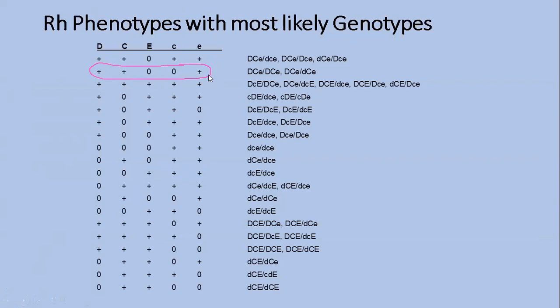Okay, so that's basically the phenotype, and we just happen to get the phenotype using the gel method instead. And so in this case, the most likely genotype would be this first one, and it happens to be big D, big C, little e from one parent, and the same exact haplotype, big D, big C, little e from the second parent. And so if you were with me, I would be quizzing you. Big D, let me get my pen.